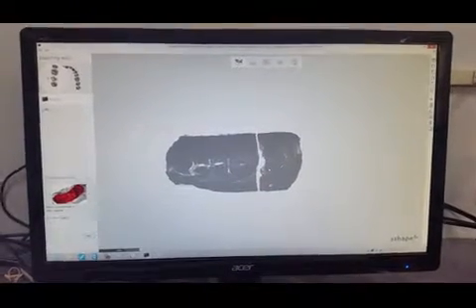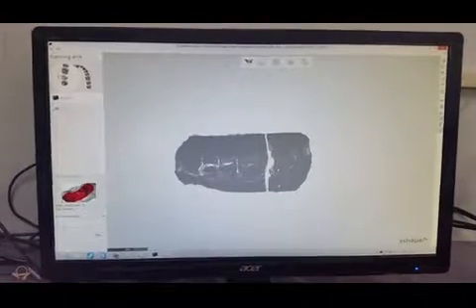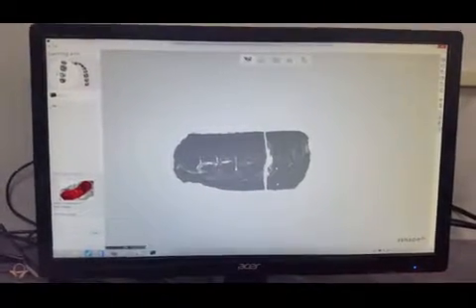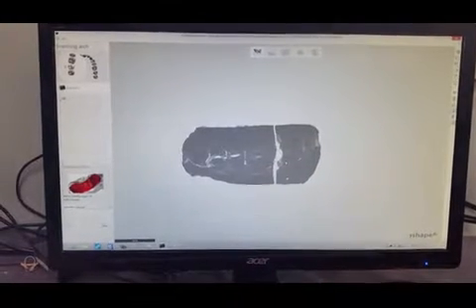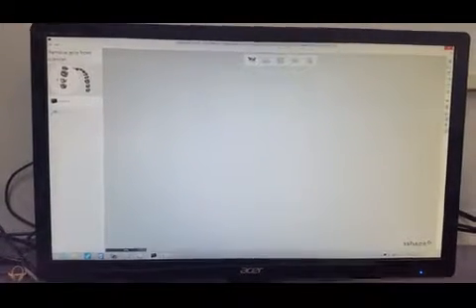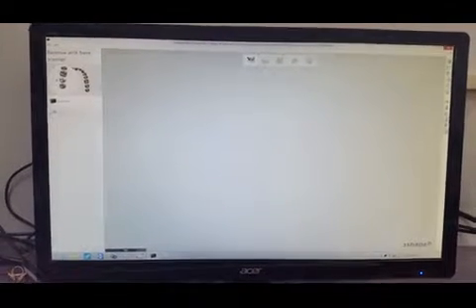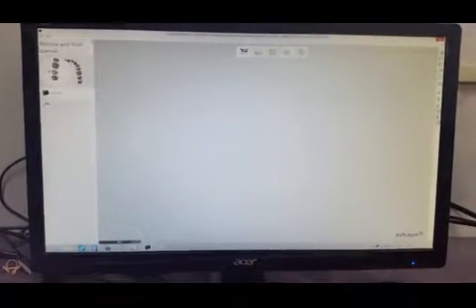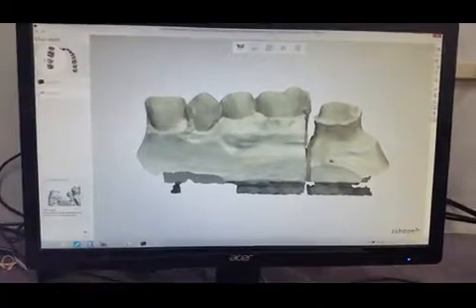A single case like this would probably take on average about 10 minutes. The 3Shape scanner is known to be one of the fastest, if not the fastest scanner in the market. But it also depends on how many units is the case, what are we trying to accomplish, and all that.